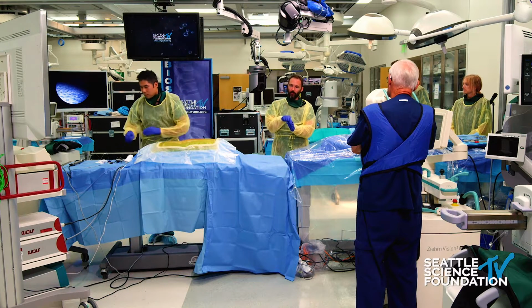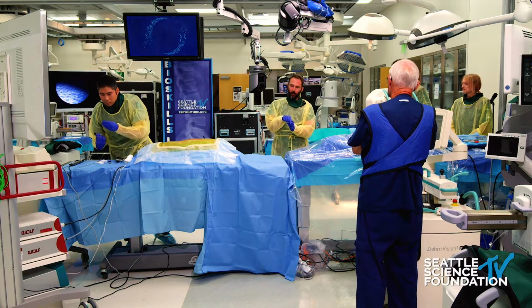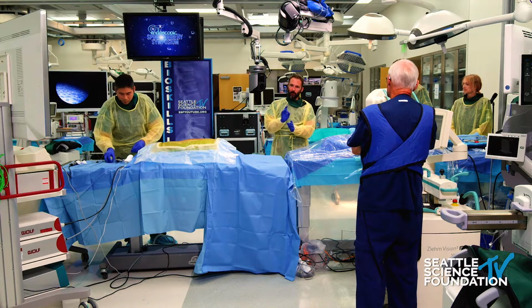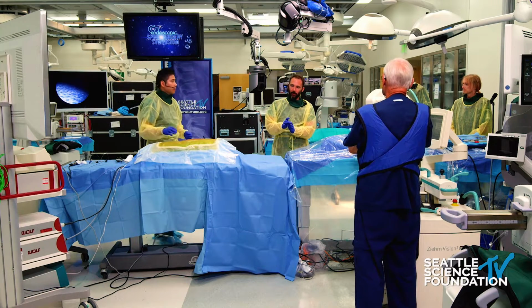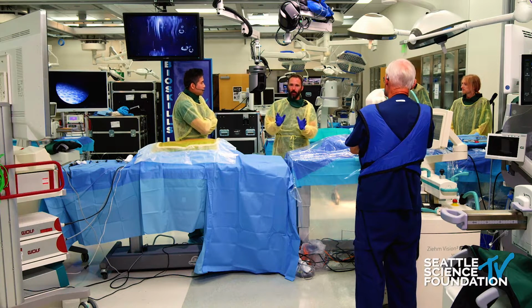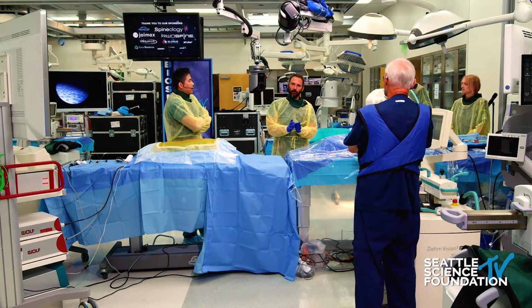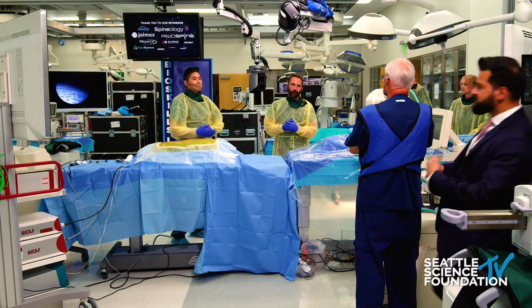I'm at the level of the fascia. I'm through the level of the fascia. Then I put the pointer right down on the lamina, and I scrape along the inferior lip of the lamina to make sure that all of my bony landmarks that I've identified in my mind and on navigation are confirmed before I start going down and dilating with the actual working channel. For me, it just makes that approach safer, and I feel like I can move through it quickly and still feel like I'm doing it safely. That's where I think it adds the most value, really.